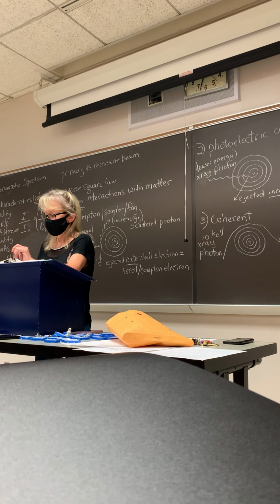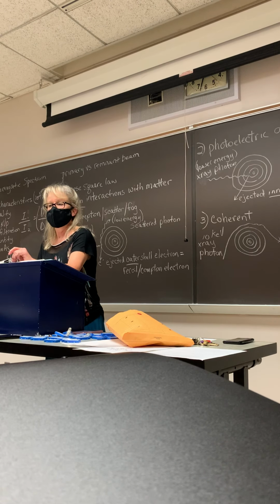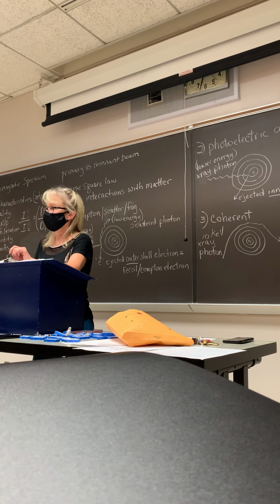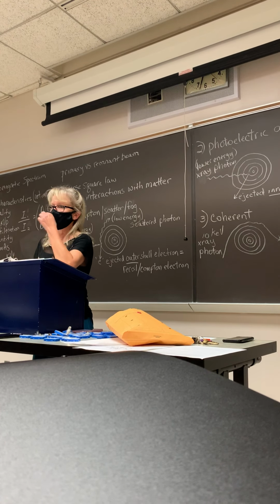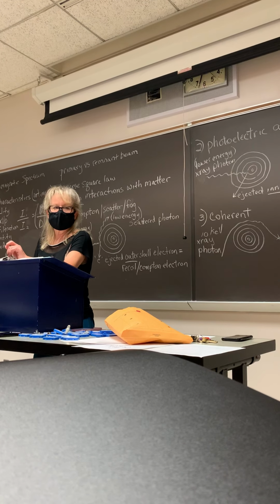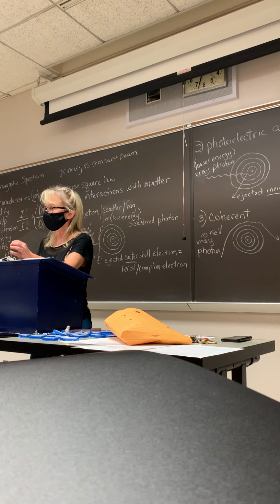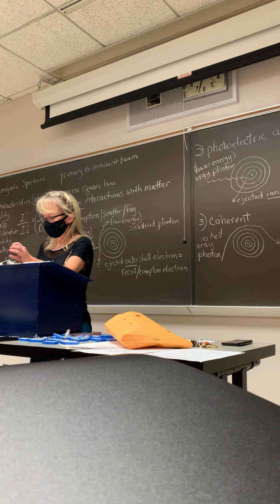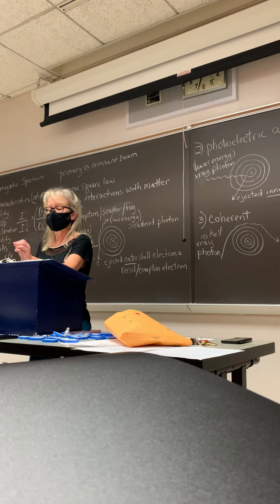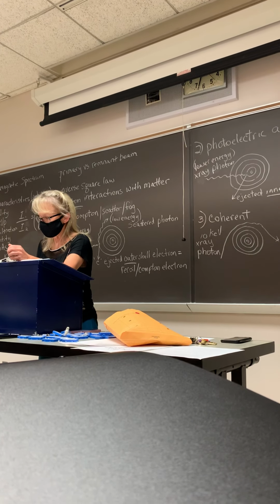Okay, the other type of secondary radiation is leakage. That comes from the X-ray tube other than the window itself. We get some leakage. So here's another number you need to know. Leakage radiation cannot exceed 1 milligray per hour at a distance of 1 meter.